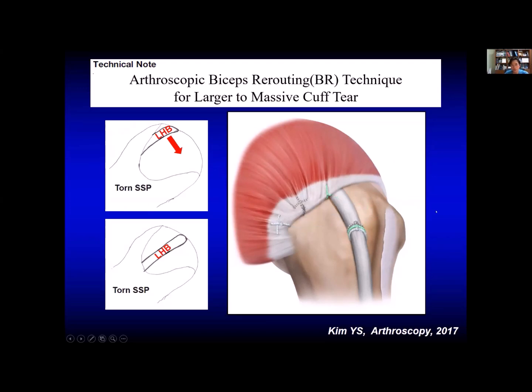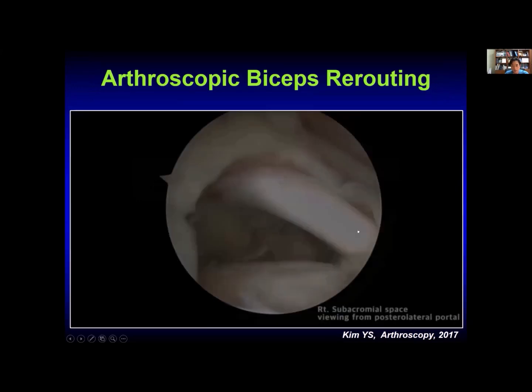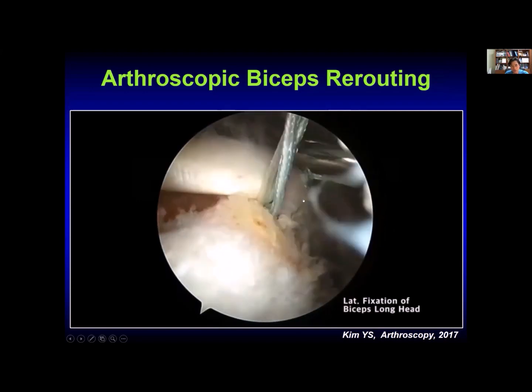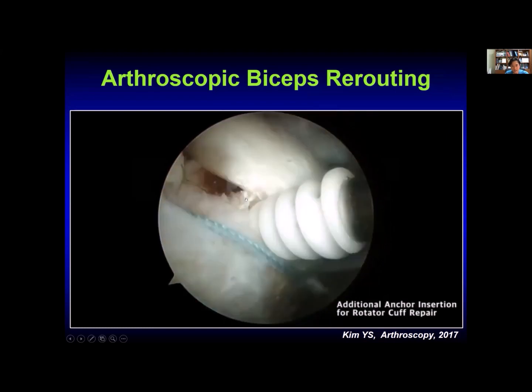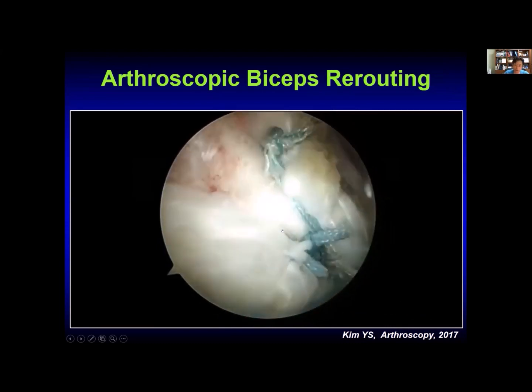This is the original technique of biceps rerouting. This is a video of my patient, his right shoulder. I inserted the lateral anchor, released the biceps and rerouted it to the center, inserted the medial anchor and tied the biceps like this, then added a suture anchor, repaired the cuff tendon posteriorly and finished the operation.